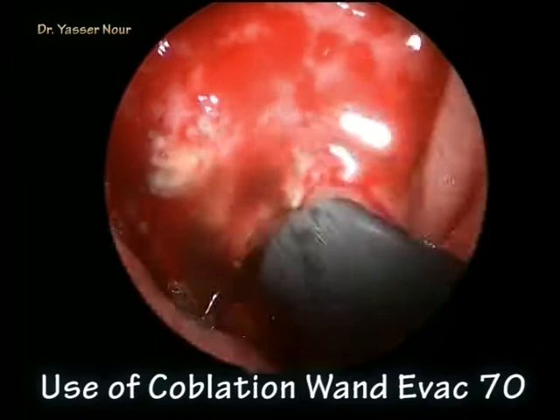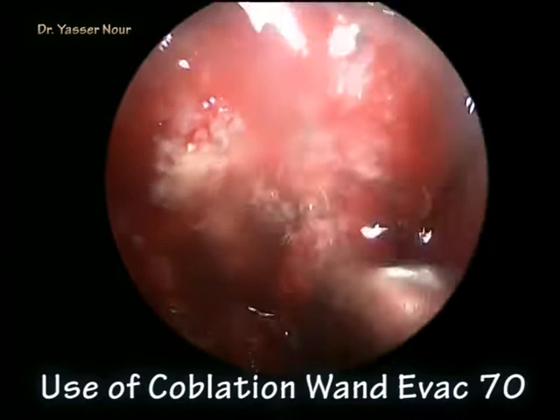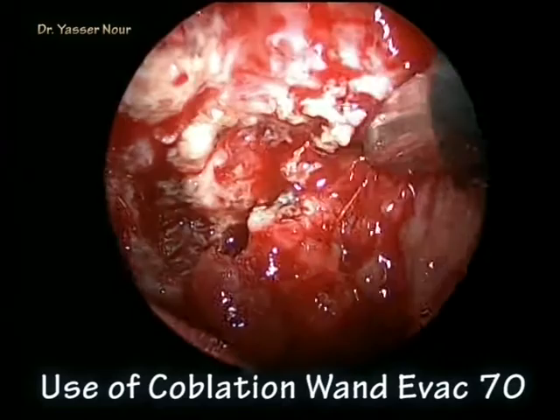It is not a lengthy procedure. The main advantage is that it is performed under complete visual control using the 45-degree lens, so you can entirely remove any remnant of the adenoid and at the same time ensure adequate hemostasis.